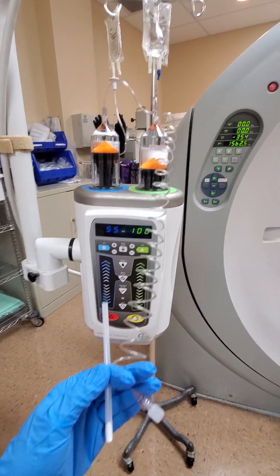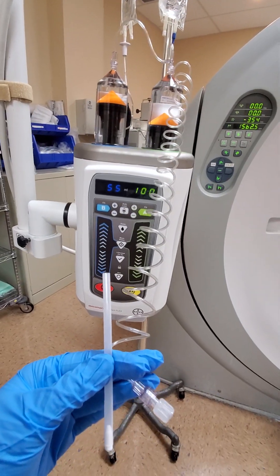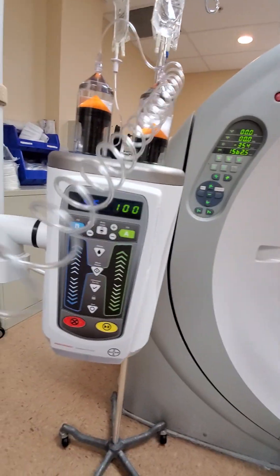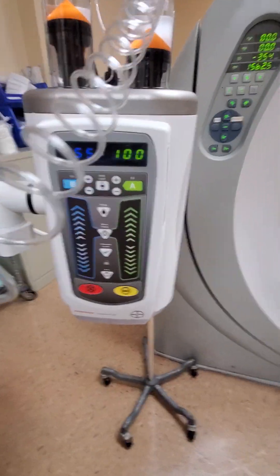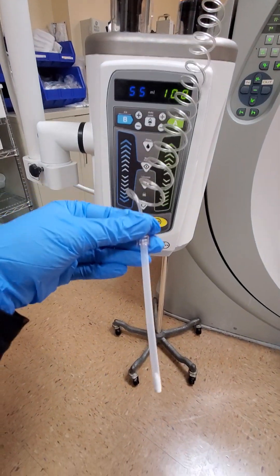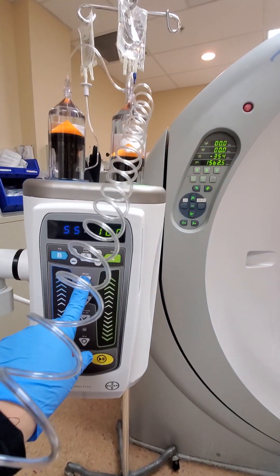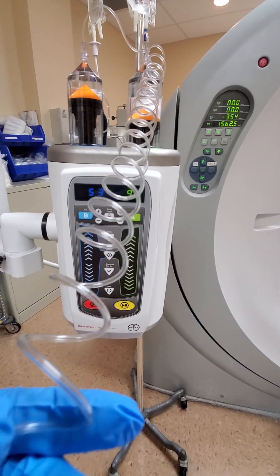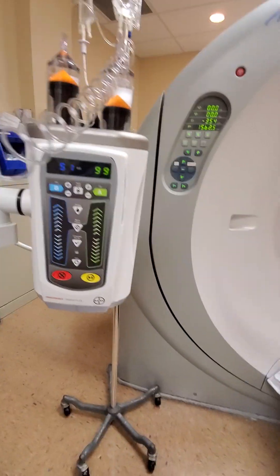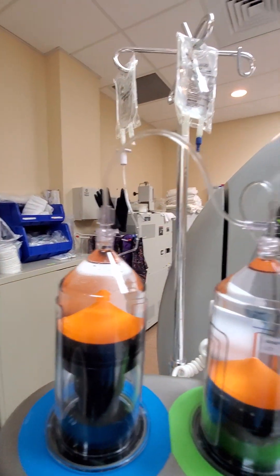Now I'm going to prime the air out of the tubing so it's already prepared and ready to go when the patient is here. I'll uncap that and put this tube on the bottom so it doesn't leak out onto my scrubs. Now I press prime — and the air has been taken out.